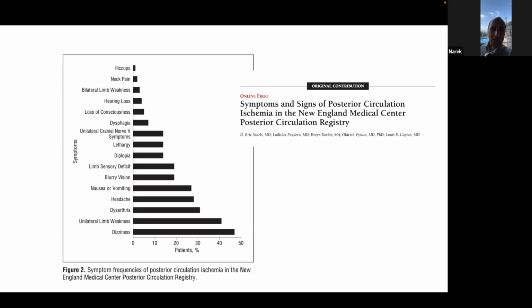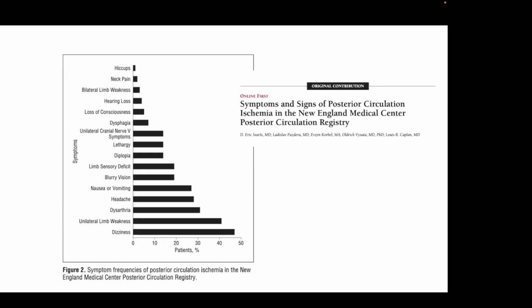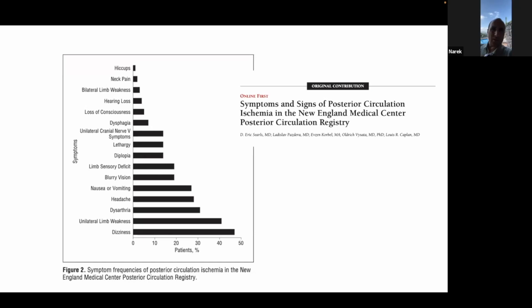In some cases, they just go to the neurologist who tells them what kind of treatment to get, and they go home if it's not a big area. What do you think? What is the best time for the follow-up? How many weeks after shall we call them to the MR to see the difference in the lesion? What's your opinion?